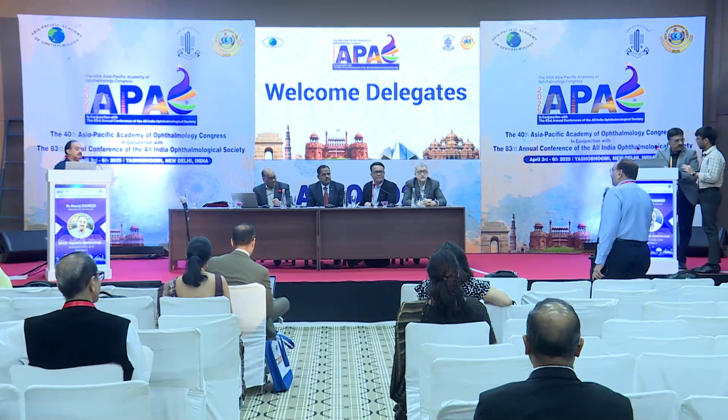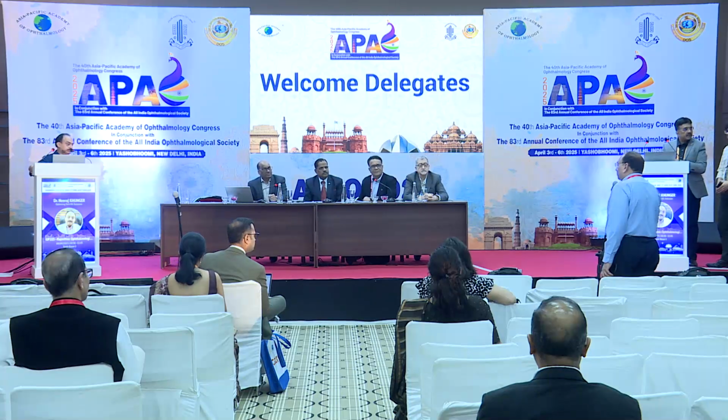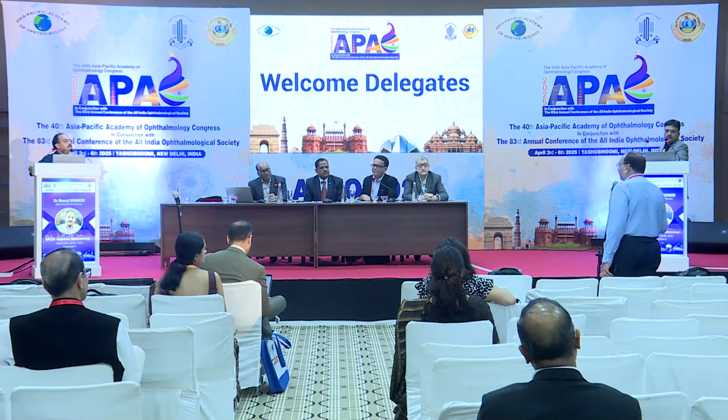Dr. Arun, would you like to share a very short comment? I very much agree with Dr. Gulam that now if you're planning for emmetropia for the patient, even if there's a 0.75 cylinder or even 1 cylinder, and the patient is going for an EDOF or a multifocal IOL, we'll go in for a toric. Earlier, our cutoff was maybe 1 or 1.25 cylinder, but these days with good surgical outcomes and predictable results, we even go with 0.75. And if there's less than 0.75, we try and adjust with the site of the incision.